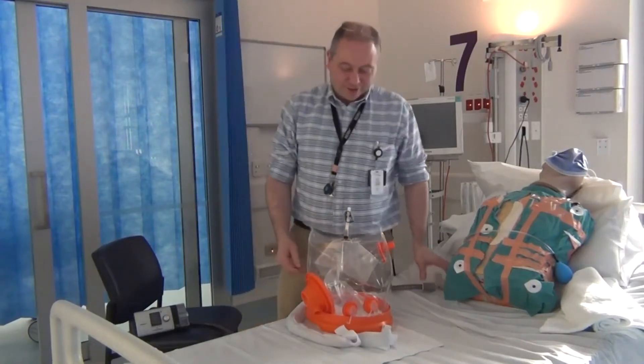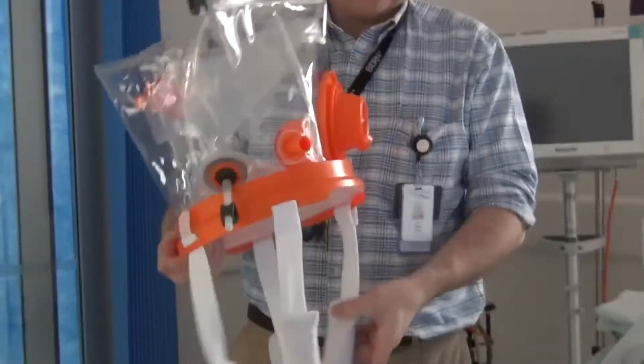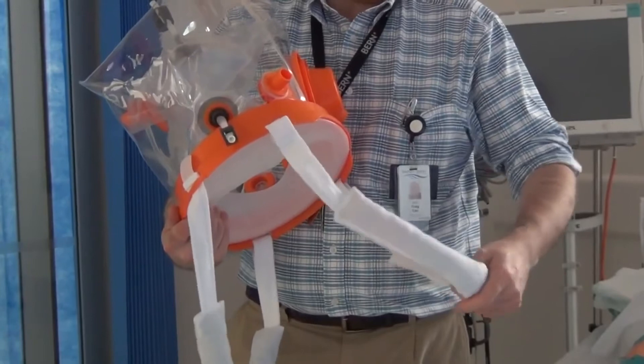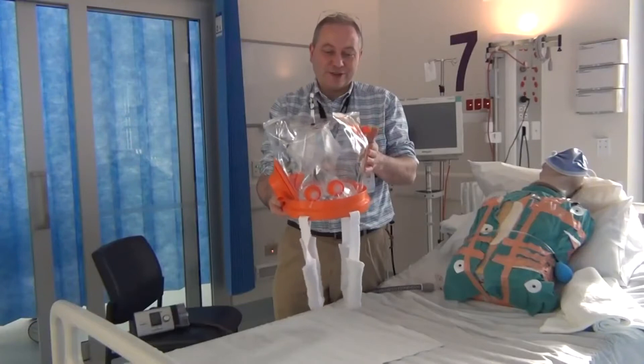For those of you who are not familiar with helmet ventilation, the helmet itself has several components. There are the straps here that sit under the arms and prevent the helmet from rising when there is pressure in it.